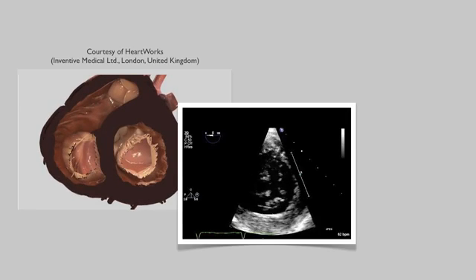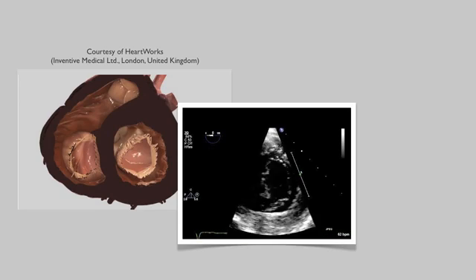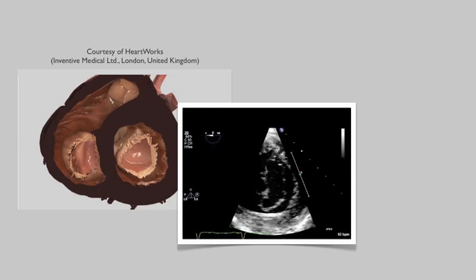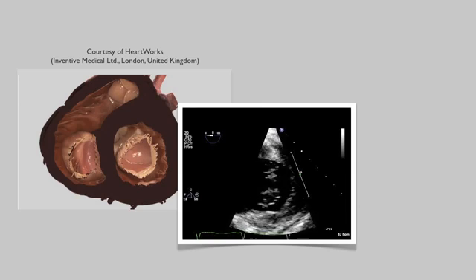The image on the right shows an echocardiographic view of the mitral valve in the transgastric basal position. In this view, the posterior leaflet appears on the right of the screen, while the anterior leaflet appears to the left. Note that the posterior leaflet takes up more of the annulus, while the anterior leaflet takes up more of the interior of the mitral inflow tract.